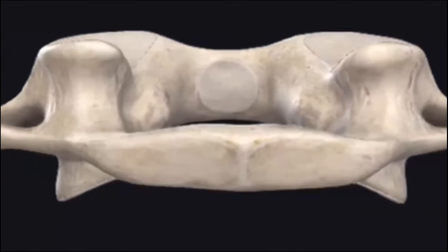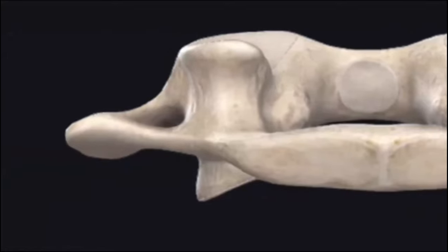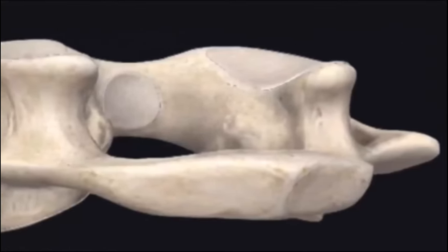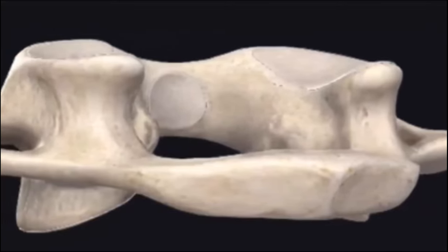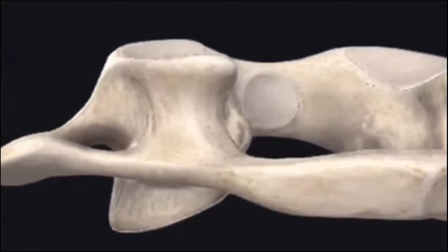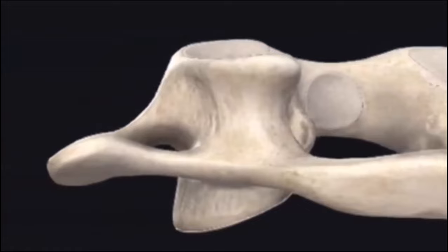In lateral mass screw placement, the screw is directed medially and upwards 5 to 10 degrees, aiming for the anterior tubercle of the atlas. The foramen transversarium of the atlas with the vertebral artery is thus lateral to the trajectory.